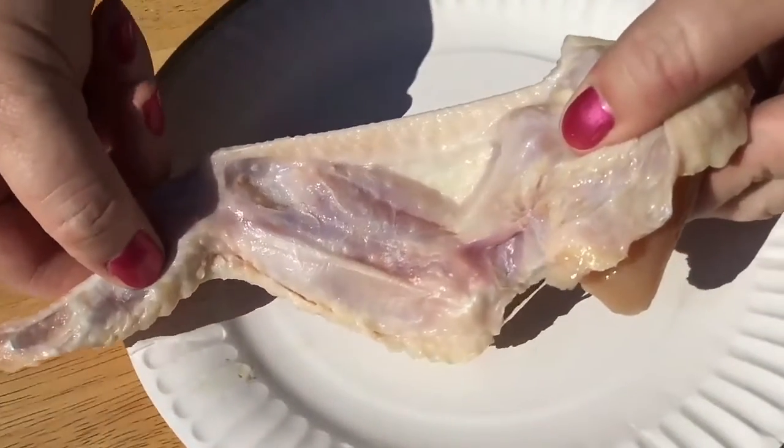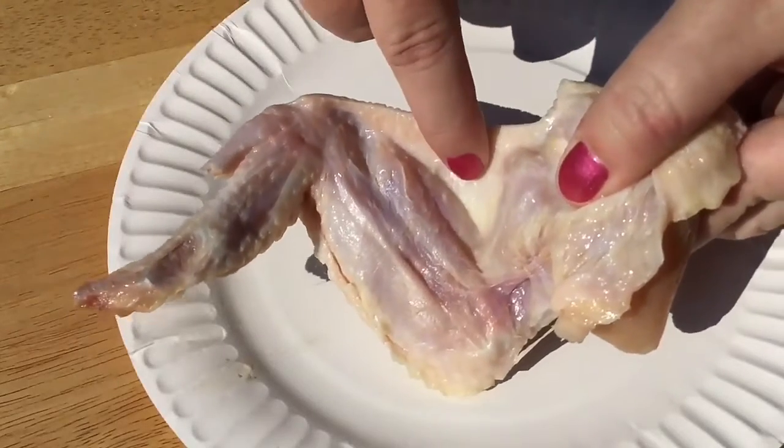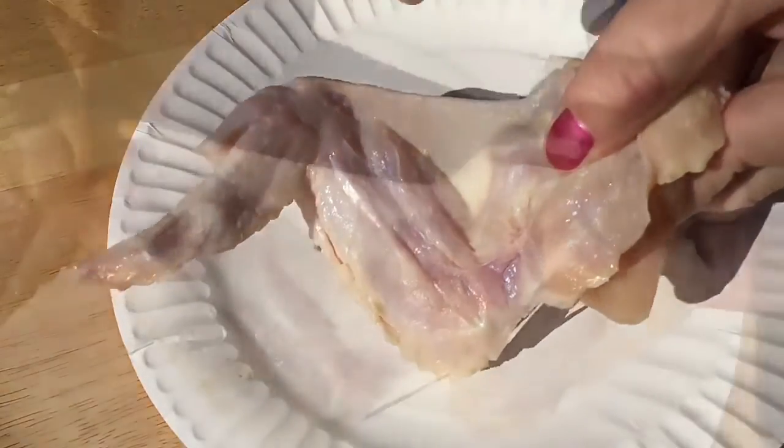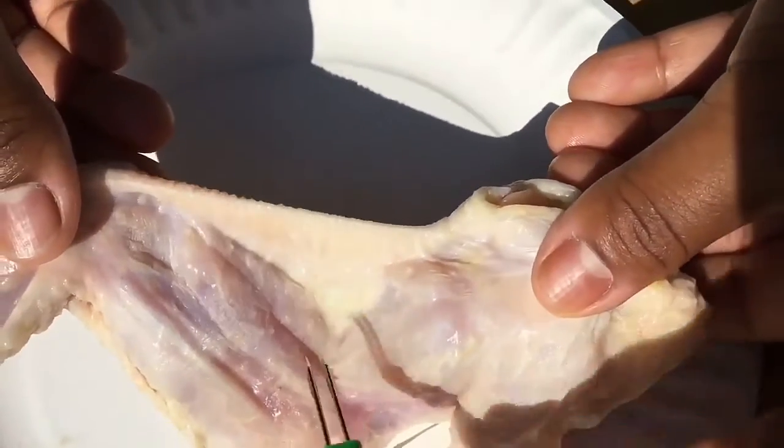You will be vaccinating your chickens in the portion of the wing called the wing web — it is the thin part located here. You can practice on a store-bought chicken wing, being sure to press all the way through the wing web.